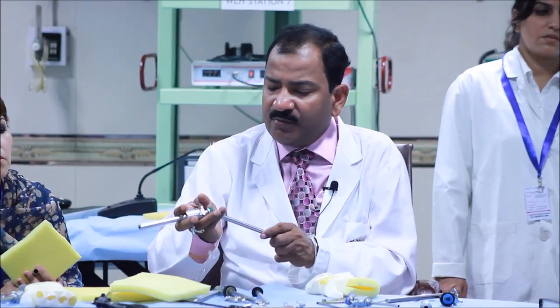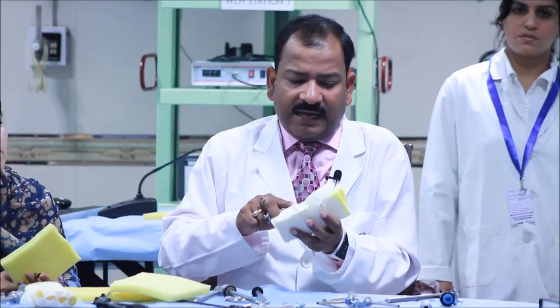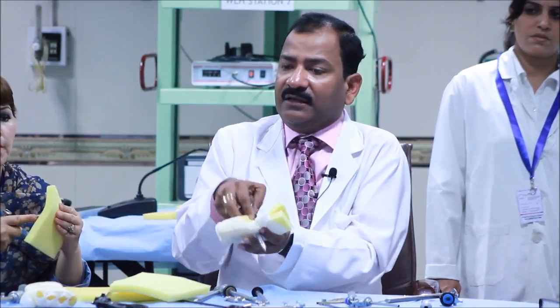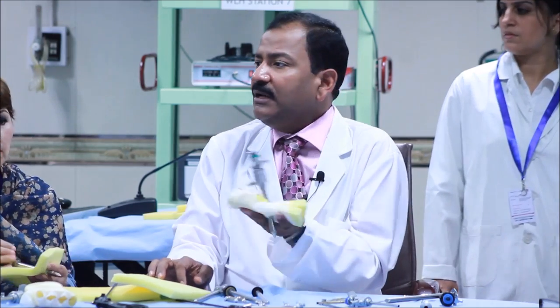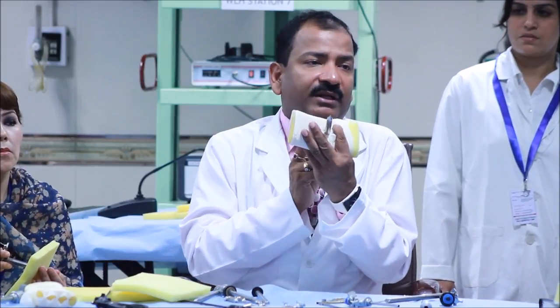Always, whenever you have to put the trocar and cannula, go perpendicular to the abdominal wall. Wherever it is, suppose it is here, you go like that; if it is here, you go like that. Go perpendicular to the abdominal wall, and as soon as the tip of the trocar is anchored, now you can change the direction so that it is perpendicular. If it is perpendicular, there is no force. You can move in any direction with absolutely no force on your movement. See, even as I am moving, there is no tear in the peritoneum. So that's why you should put the trocar and cannula perpendicular.